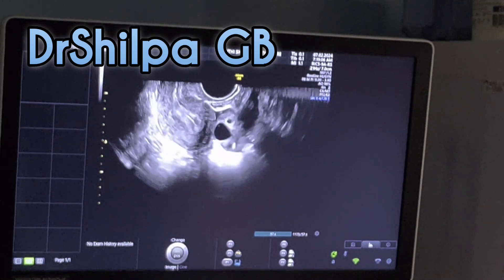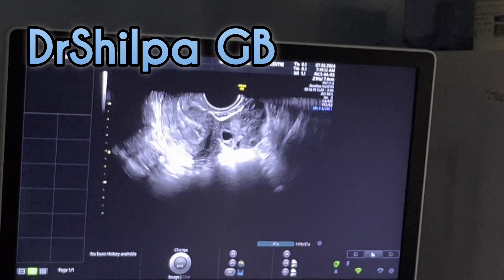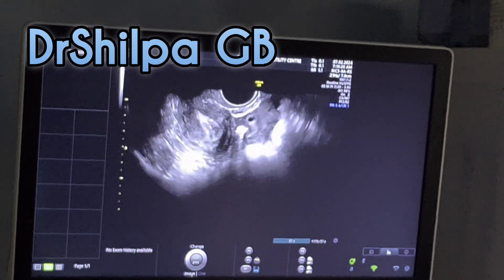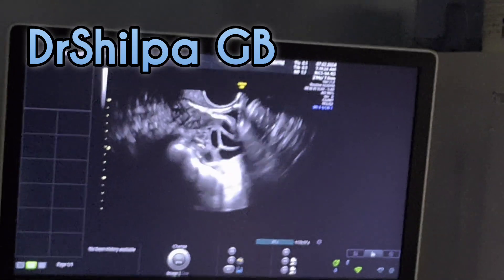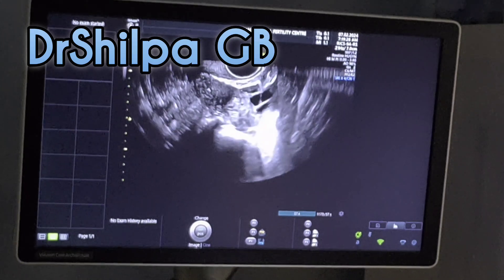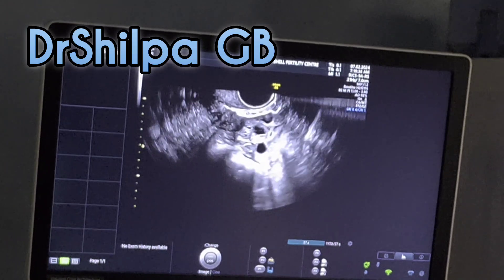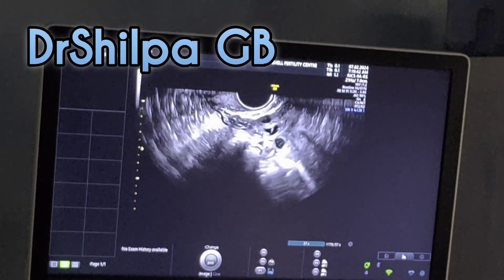It is quite a simple procedure where the oocyte — the egg — will be in this fluid. We will aspirate it into the test tube, and the test tube will be handed over to the embryologist. That is why this procedure of IVF is also called test tube baby.